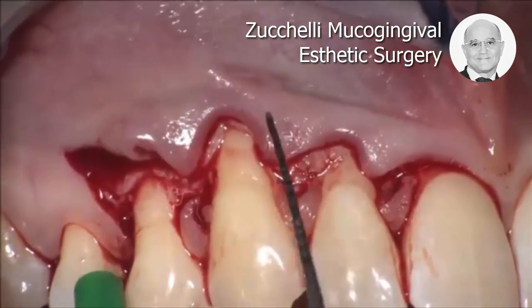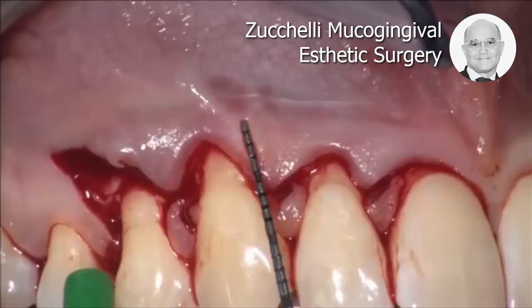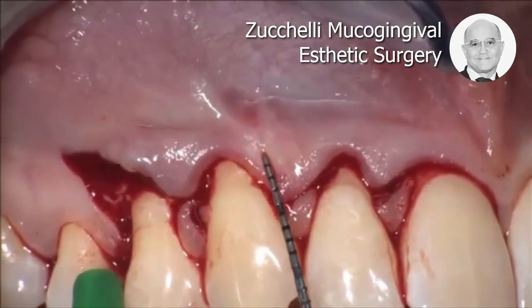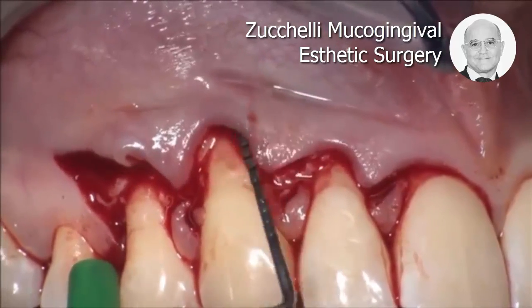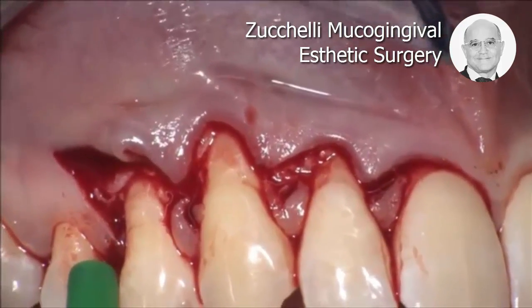You see how thin the lining mucosa is exactly in this area where it was almost attached to the periosteum. It's very, very risky in this area, because the lining mucosa is very, very close to the periosteum.